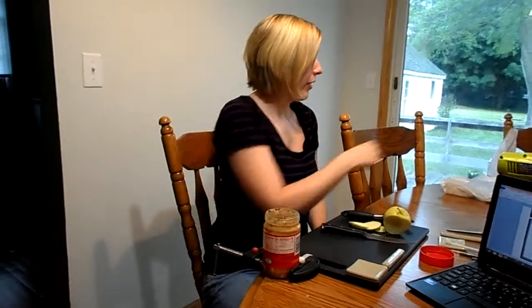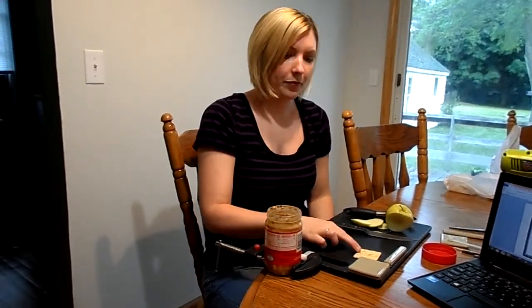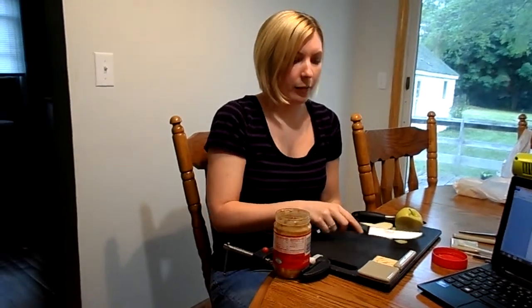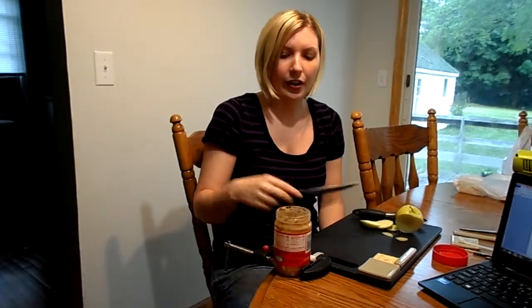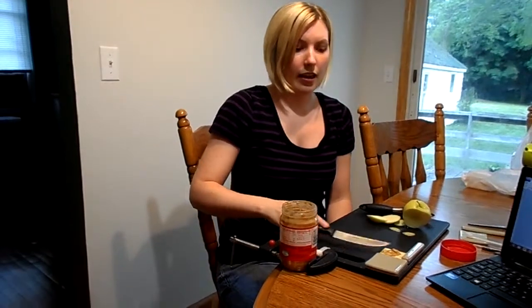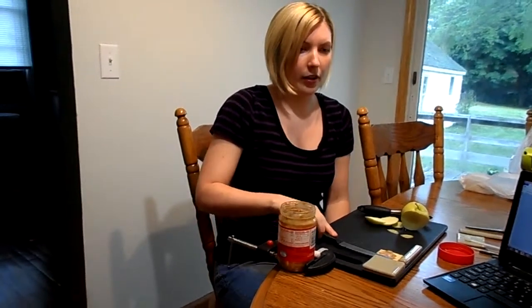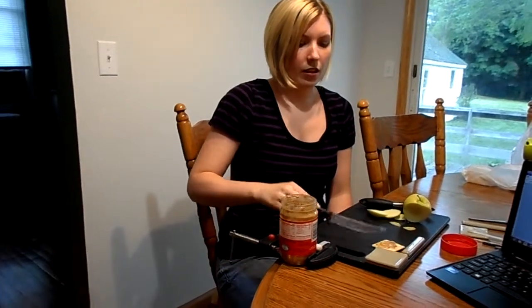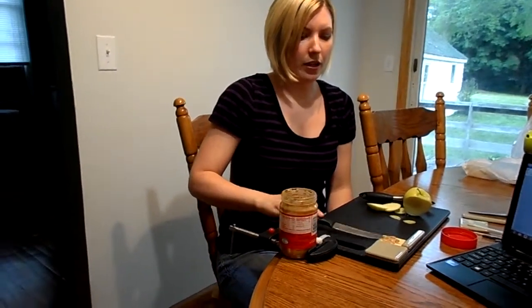And now I'll place my cracker in the bumper system here. So it's not going to slide all over, and it will provide some resistance while I spread the peanut butter. And the clamp system securely holds the peanut butter while I scoop. So I get some peanut butter on my knife, and I can go ahead and spread my peanut butter. And it's still difficult, but it's much easier.